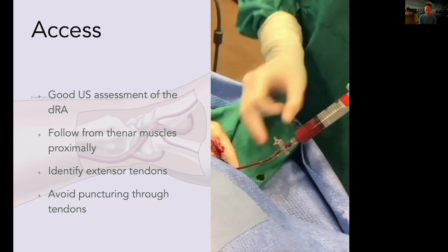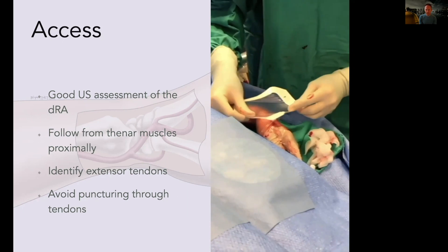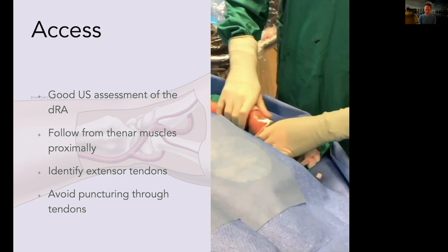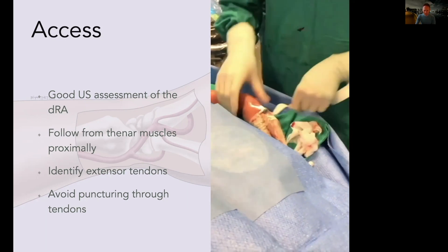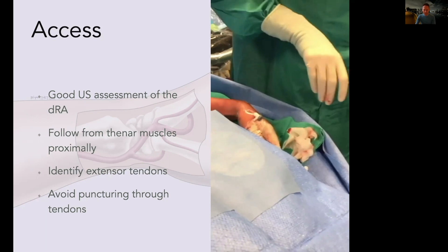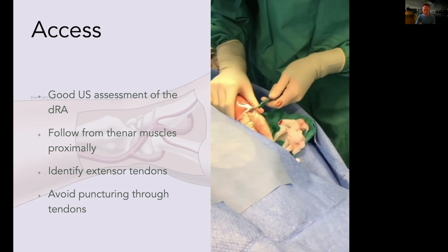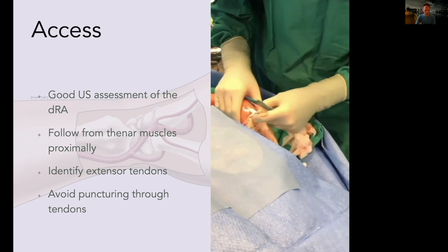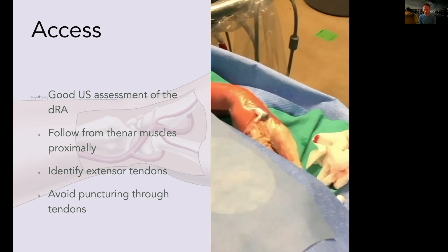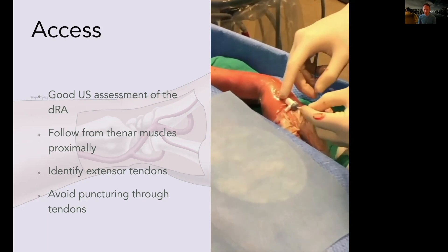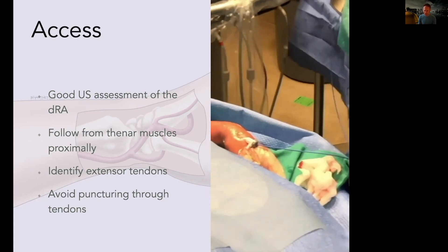Once I've got my sheath in, I cover it with a tegaderm to prevent it from slipping out. This is my radial cocktail — I dilute it with blood to decrease pain, inject over 30 seconds, then flush the sheath with saline. I put a tegaderm over the sheath because otherwise it will slip out — there's no subcutaneous tissue. I make a little nick in the tegaderm to allow the catheter through. Importantly, identify your extensor tendons and absolutely do not puncture through them — it can be devastating, causing pain, long-term sequelae, and tenosynovitis.